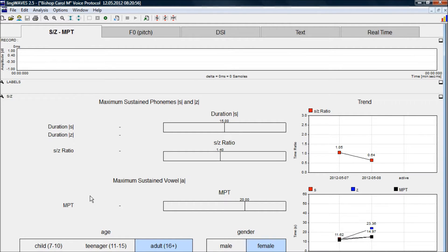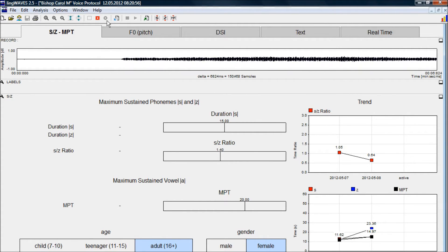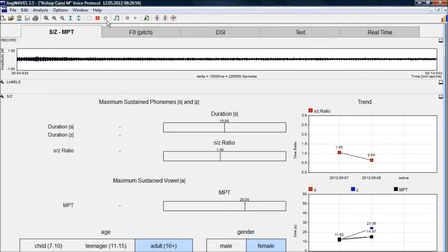The first screen we see measures the S to Z ratio and the maximum phonation time. You ask your client to say S for as long as they can, Z for as long as they can, and then a vowel R. We record with this button.